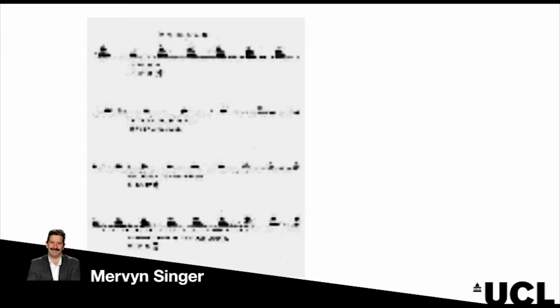And we started him on some inotropes. The blood pressure came up a bit, the stroke volume improved. We increased the dobutamine to further augment his cardiac output, and there was a much healthier looking Doppler signal suggesting a much better cardiac output. And in conjunction with that, he now had an acceptable blood pressure. So that's just one anecdote of how it could be used.